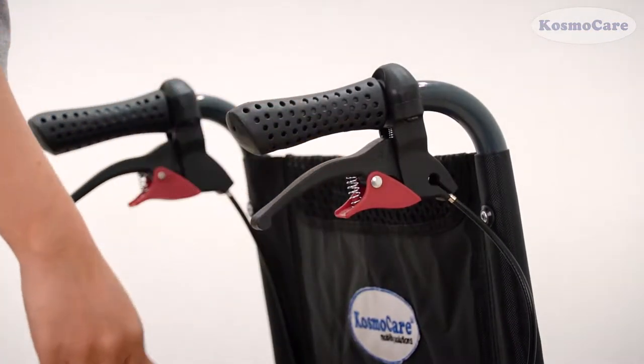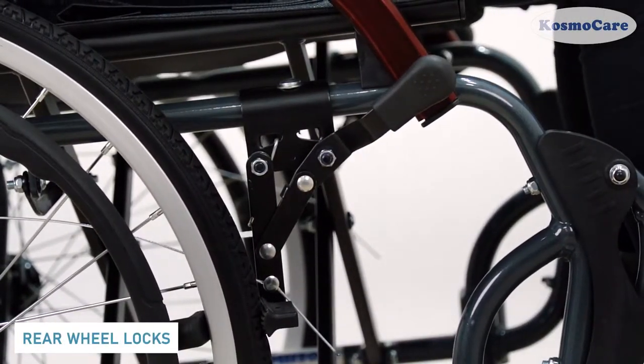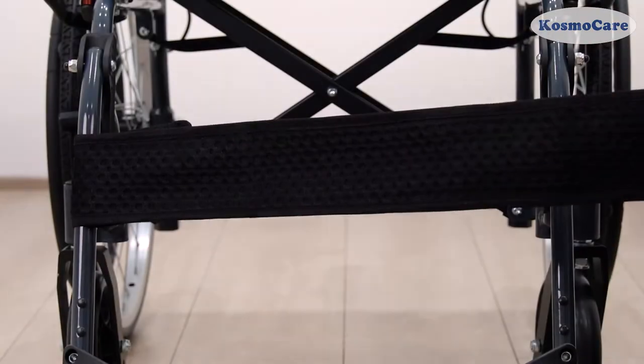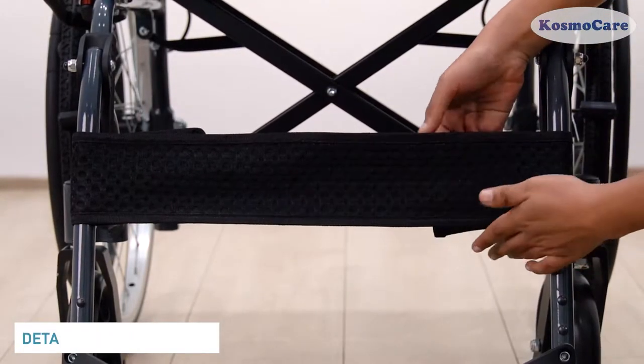The attendant hand brakes and rear wheel locks provide absolute comfort and safety. The footrest comes equipped with a detachable calf strap to support the legs.